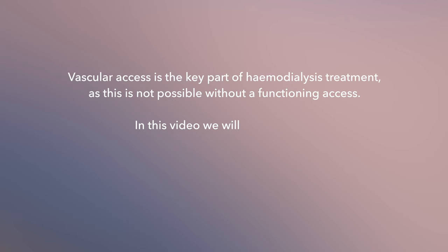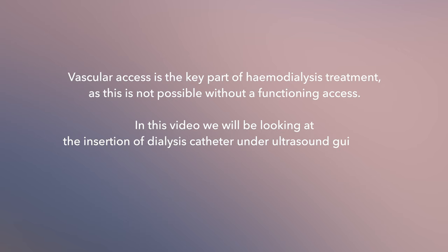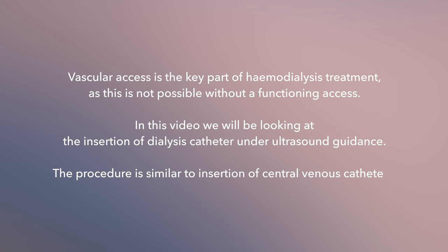Vascular access is an important part of hemodialysis treatment, as this is not possible without a functioning access. In this video, we will be looking at the insertion of a dialysis catheter under ultrasound guidance.